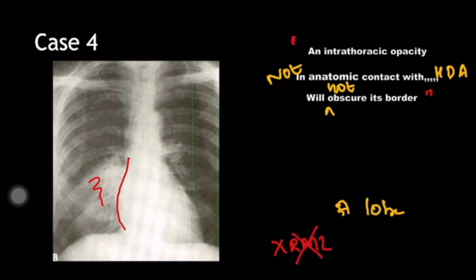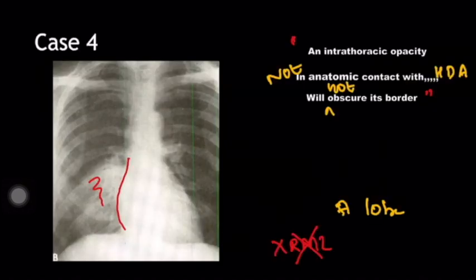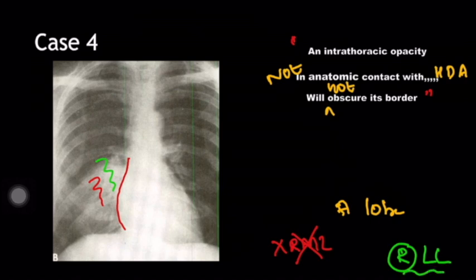Going back to the segmental anatomy, the diaphragm is in contact with the basal segments of both lower lobes. But there is also a superior segment of the lower lobe that is not in contact with the diaphragm. Going by the segmental anatomy, this lesion could likely be in the right lower lobe — to be specific, the superior segment. So you can definitely rule out its location being the right middle lobe.